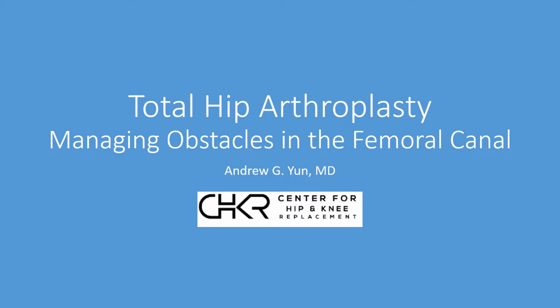It turns out that some patients present with an additional history of trauma, hip fracture, or some type of injury, now with associated plates, screws, and hardware that block the actual hip replacement. Others present with an actual biologic abnormality that significantly increases the architectural and procedural challenges of hip replacement. So we'll talk about both those issues, external and internal obstacles, and how we manage them.